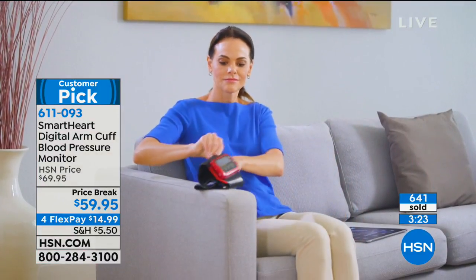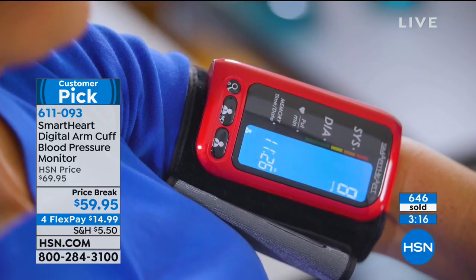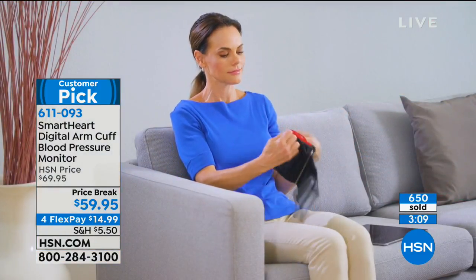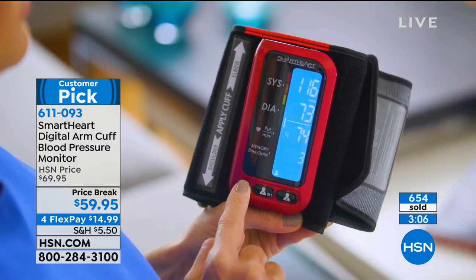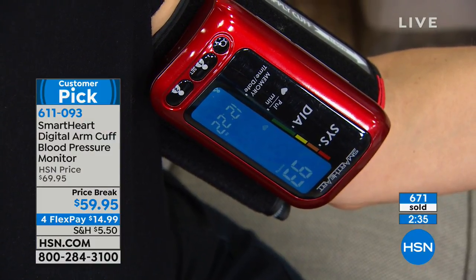I grabbed some of the reviews. A perfect five-star customer pick is pretty amazing. From South Carolina, a five-star review: 'I love this Smart Heart blood pressure monitor. The readings are accurate and it takes blood pressure quickly.' Over in Arizona: 'It's simple to use, and this will go with me to my doctor visits because of the logs that are date stamped.' That's a big deal — when you go to the doctor it's not like you just say, 'I took my blood pressure.' It shows what time of day it is, what day it is, how many times you took it. Your doctor has actual data.